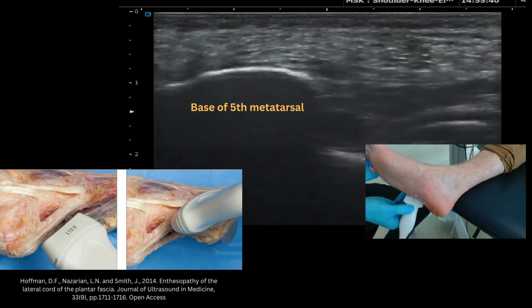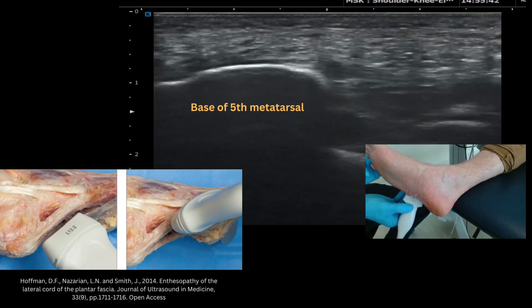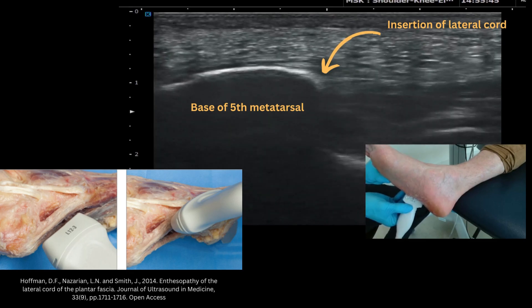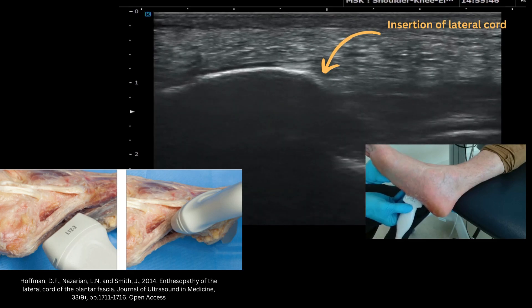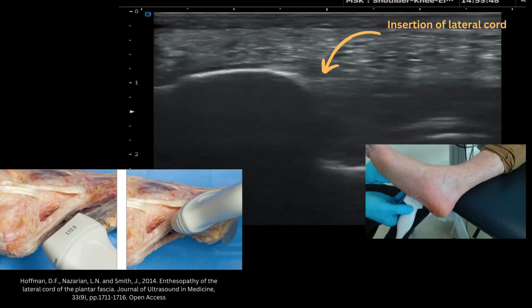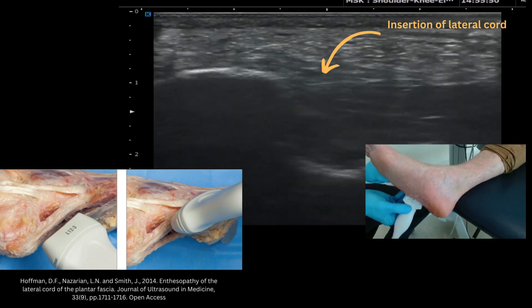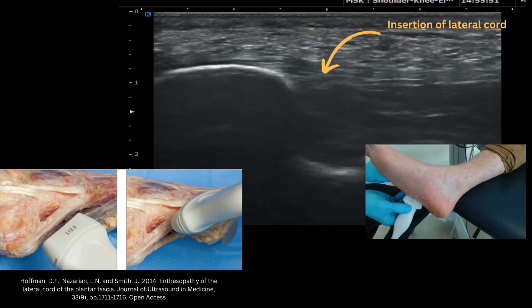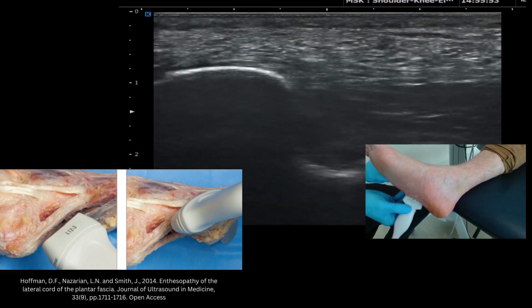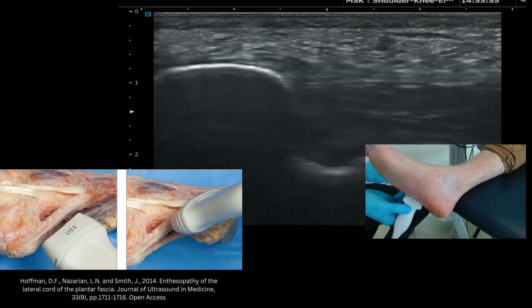You can see it here very nicely highlighted by the labeling. If you just extend the fifth metatarsal, it places a bit of tension on that tendon, which can help crisp it up and get it more parallel to the probe.